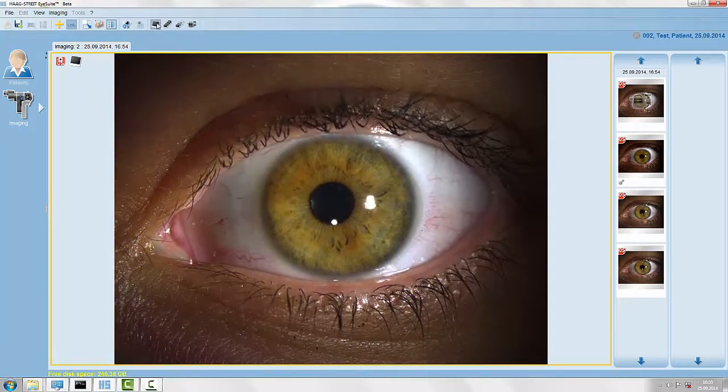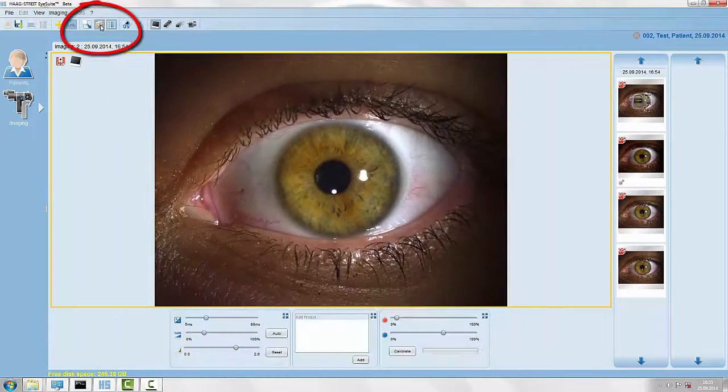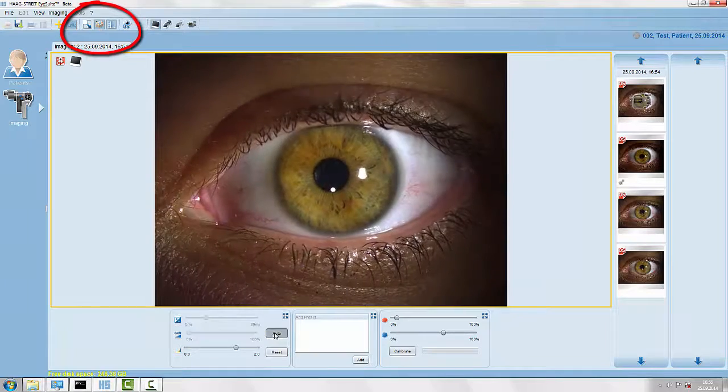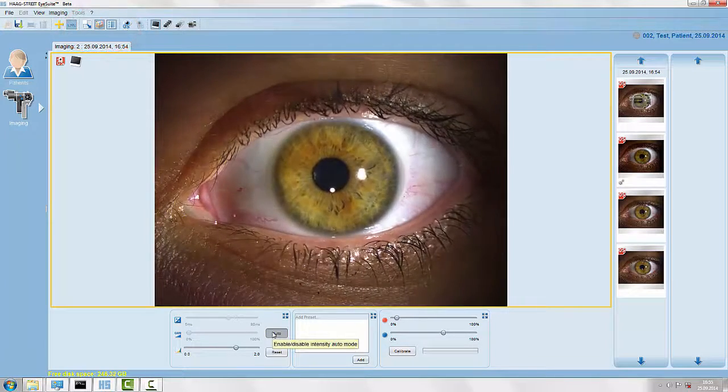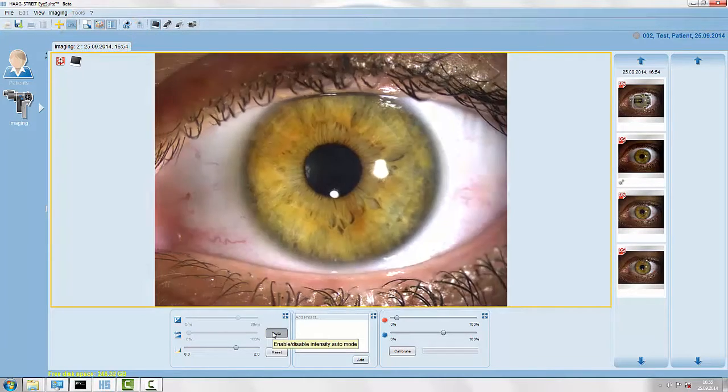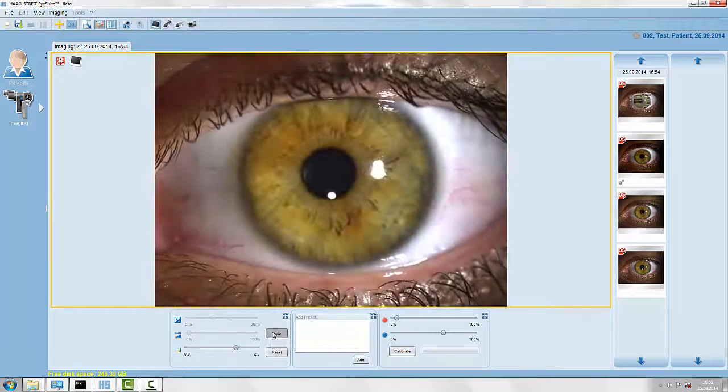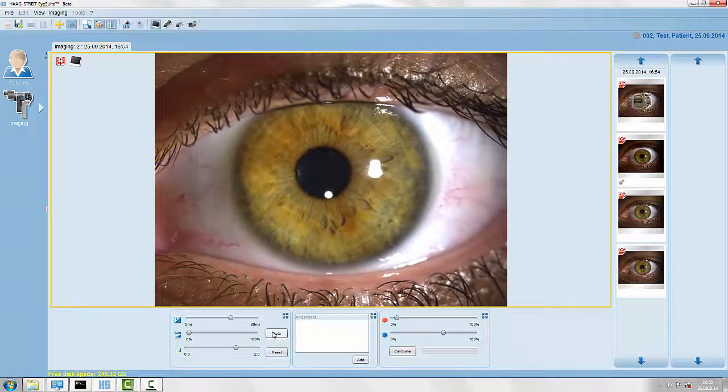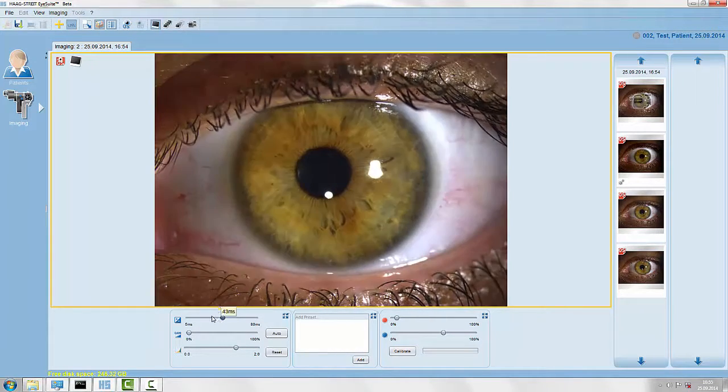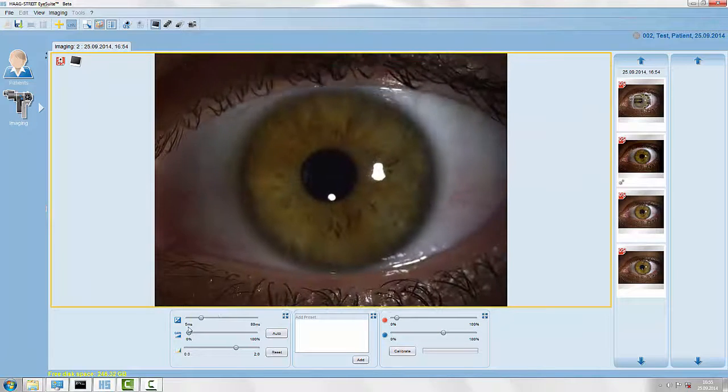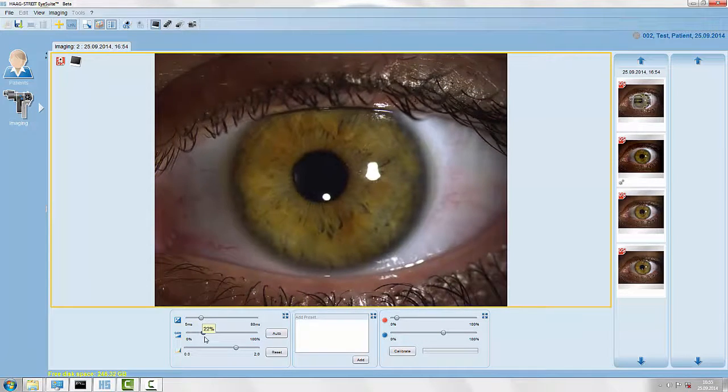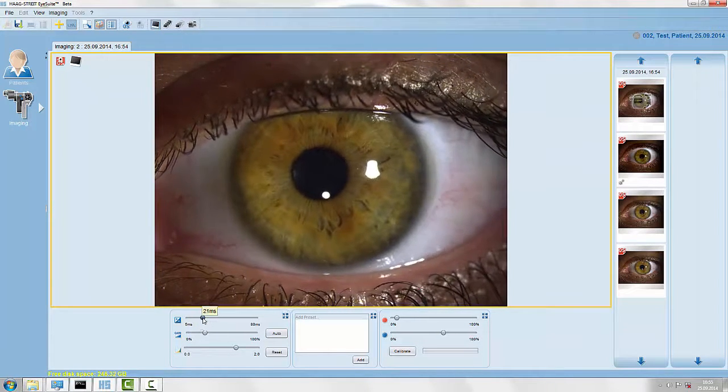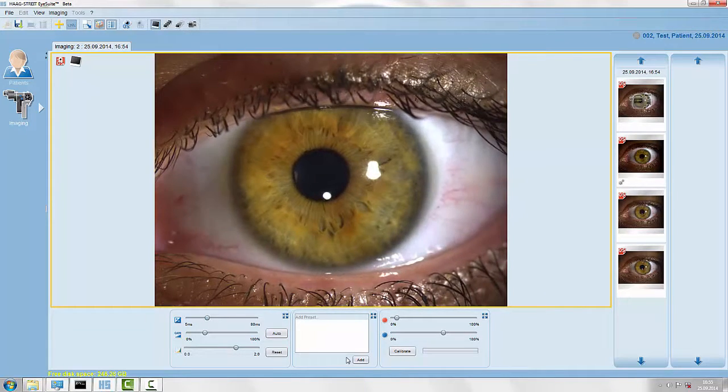In our toolbox we have the possibility to adjust the brightness of the image. We have an auto brightness control or we have the possibility to adjust exposure time and gain manually, either on the sliders here on the screen or from the release module.